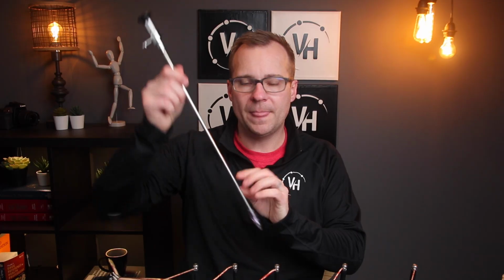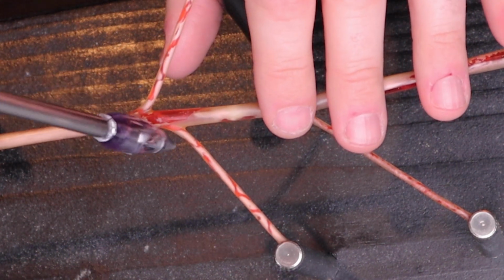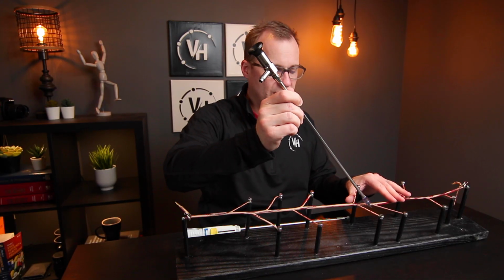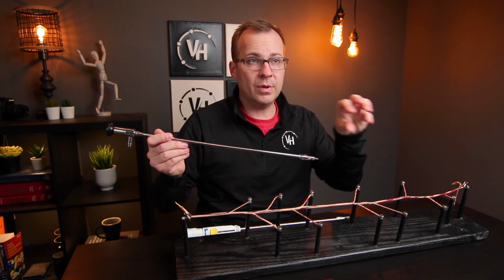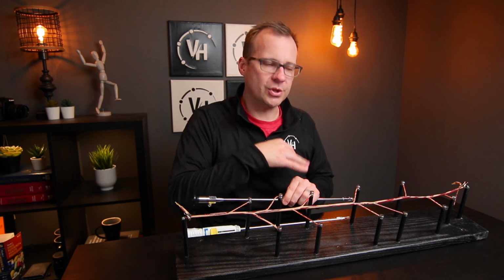The way you prevent this from happening is taking an extra few seconds right at the beginning of your harvest. Have your retractor in, you're freeing up your pocket, free up as much as you can comfortably with the scissors. And then when you get your scope, remember, we insert the scope vertically. We want to pop some windows above and below. That's how we get that tissue freed up, with this scope. As we start to march up our tunnel, if we've popped windows above and below, now we're getting rid of a lot of that connective tissue. And we can come back to our knee, get underneath, and dissect some of that out. So popping the windows above and below, right below the knee, is what's going to fix that underdeveloped dissection at the knee that's going to cause you trouble down the road.